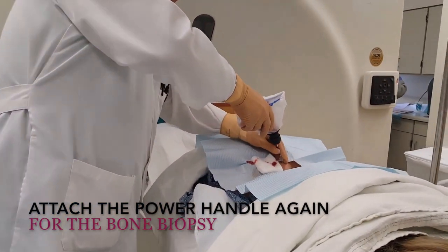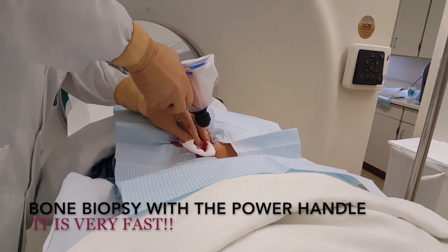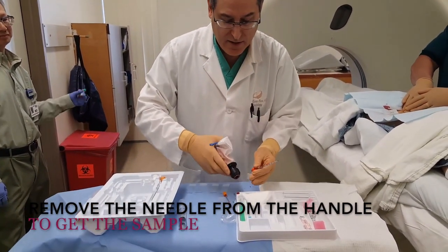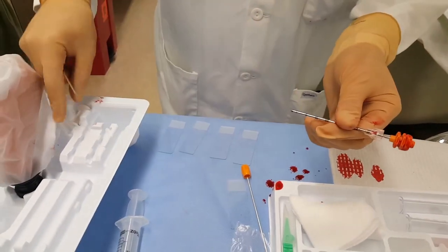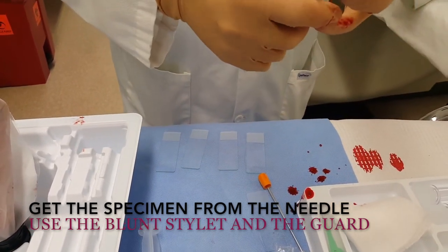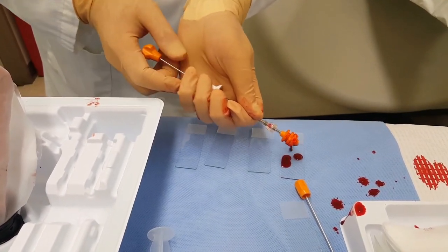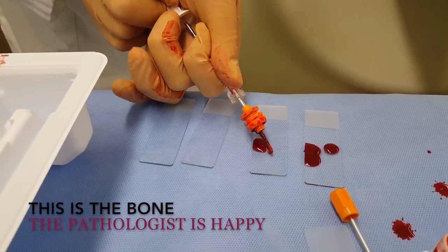Now we're going to get the bone marrow sample. So that's our sample. Now we have the bone marrow specimen in this needle. We're going to get the specimen out of the needle. It's very important to put on this sharps protector so that the end of the needle is protected — it's a blunt tip that pushes the specimen out. So I'm going to push it onto a slide. It can be a little bit of bone aspirate first, and then we can feel the bone marrow come out. It should be about 4 cm long — there you go.